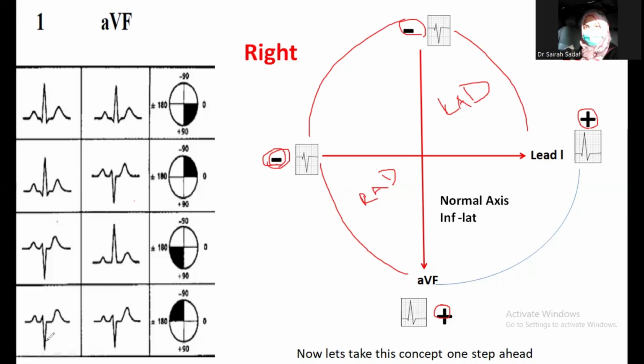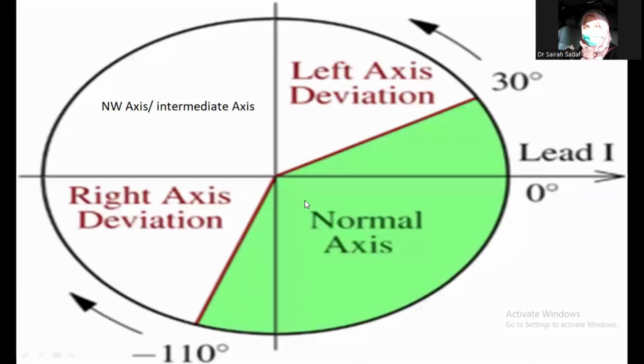It shows extreme pathology of the conduction pathway. It shows that the current is not going towards its destination. It is distracted. It is hijacked. Something is wrong. It's going somewhere else. You have to be very, very conscious when you get this situation.